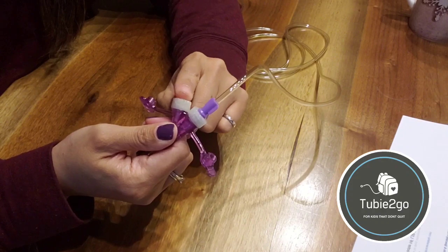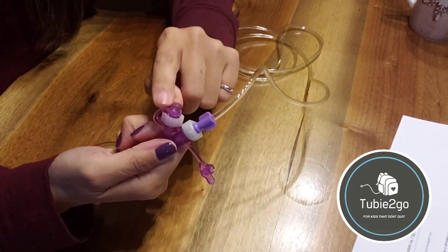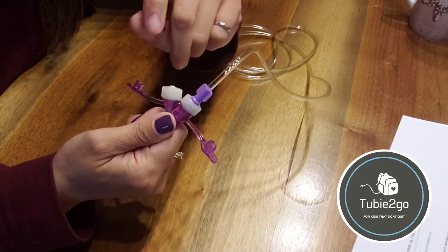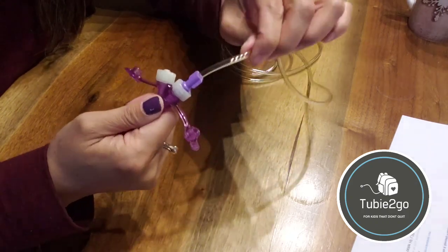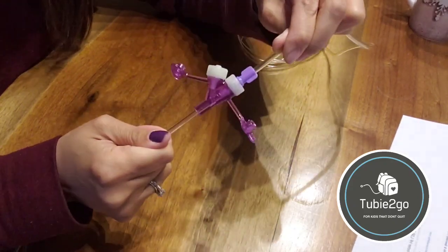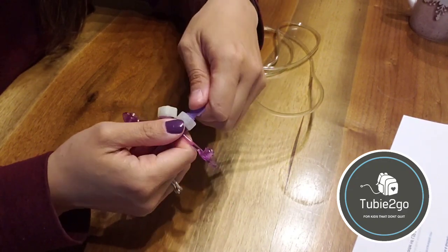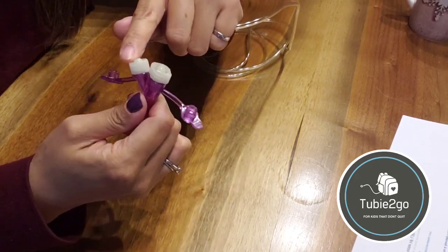So the solution that I've heard that fixes this problem best, if the cap popping off is an issue, is to take one of the caps off of a Farrell bag and actually screw it in much the way that this would screw in, so that there is something there plugging that med port and avoiding feeding the bed. But if you do have something connected in ENFit style, like the feed bag, you can be rest assured that it's not going to get pulled apart accidentally or just from rubbing come apart. Especially if you twist it in quite tight, it's going to be very secure and need quite a bit of effort to untwist.